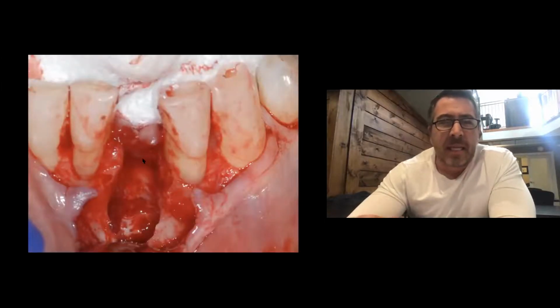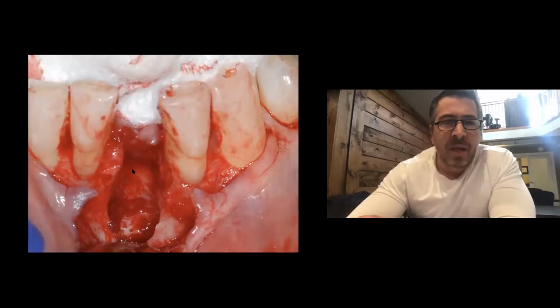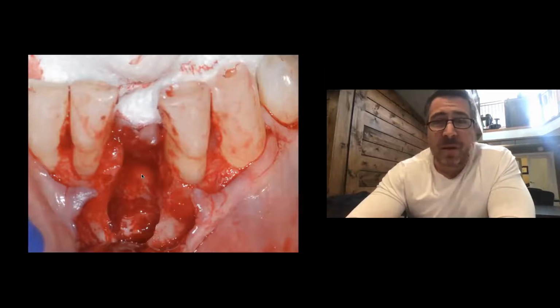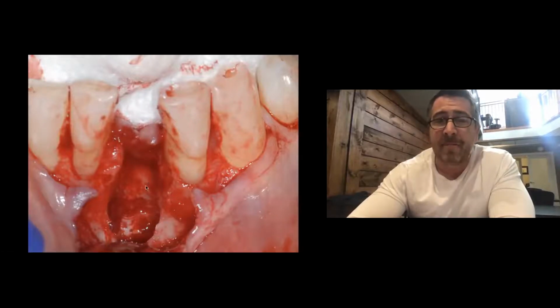So you look at a case like this. Here's a lower incisor with a big chronic periapical lesion. The tooth is extracted and you think, now again, different speakers will give you their opinions and their experience level will tell you that some people, I know Azim was talking about how he does mostly immediates, he may or may not approach that with an implant today. In my practice, I wouldn't. I would want to graft that first and I would come back in and do the implant secondarily.